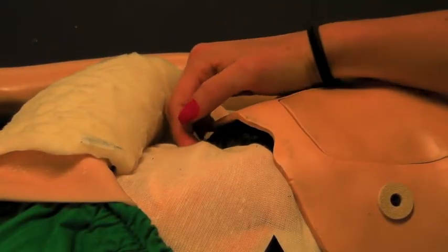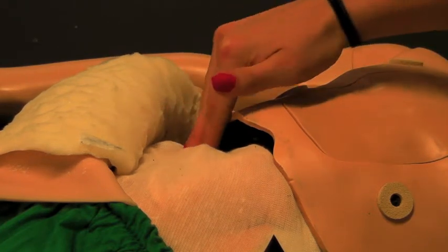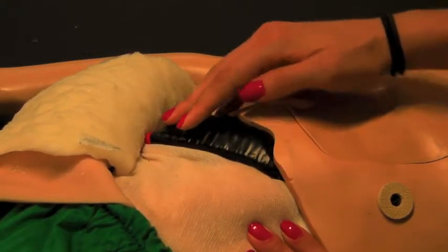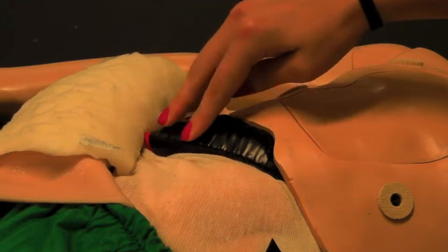Right now the liver is in the normal state. It is not enlarged, but it is still palpable underneath the ribcage, one to two centimeters. We will now enlarge the liver — the liver can be enlarged up to five centimeters. This would be five centimeters, which is the largest enlargement state.